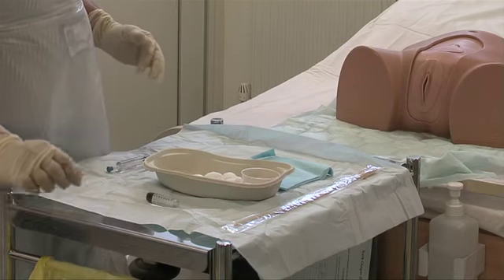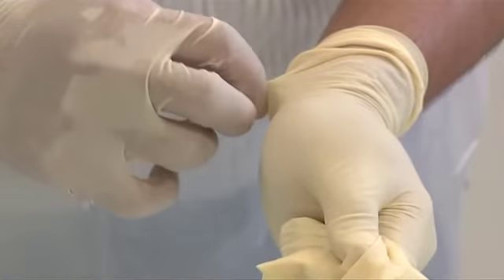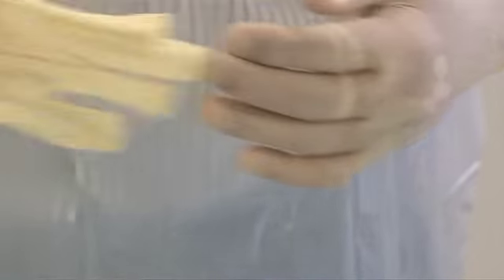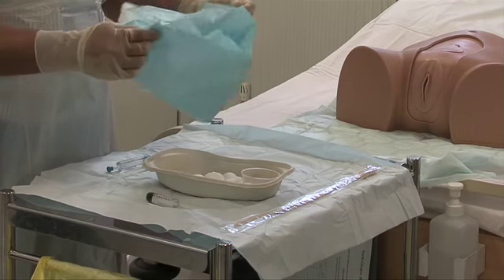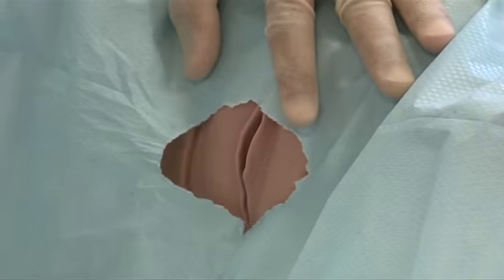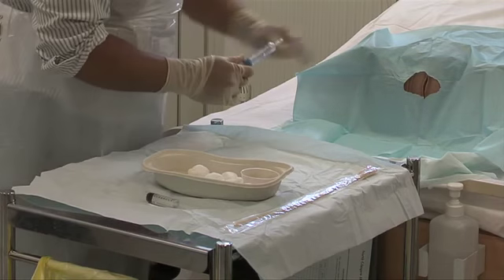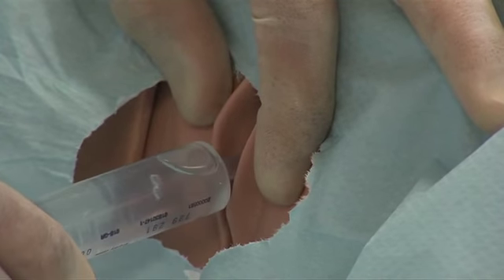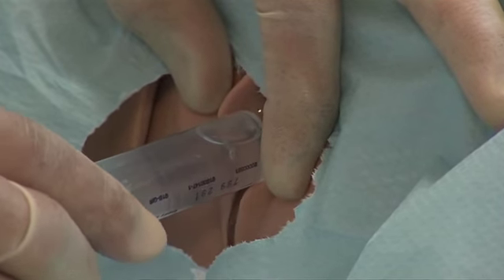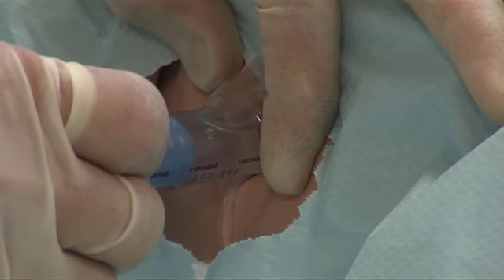Remove the outer layer of gloves, being careful not to touch the underlying pair. Place a clean drape over the patient's genital area. Using one hand, gently separate the labia minora and insert the nozzle of the lubricating anaesthetic gel into the urethra. Expel the contents of the syringe into the urethra and allow 5 minutes for the antiseptic and anaesthetic properties to take effect.